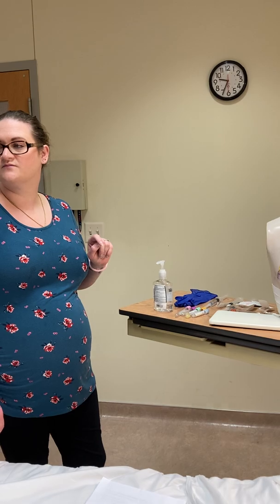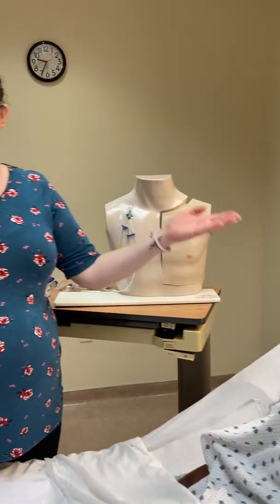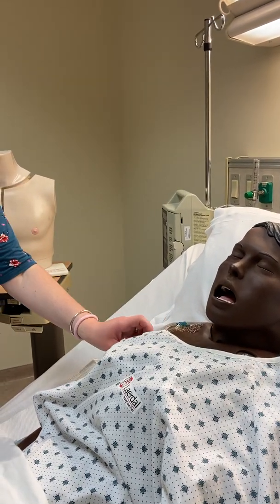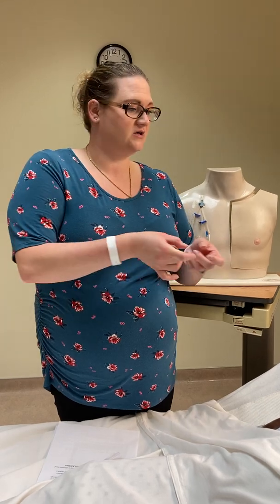For patient positioning, a 30-degree angle is fine. The patient doesn't necessarily need their head turned, but if you're having difficulty getting brisk blood return you may need them to turn their head or raise their arm — these lines can get a little finicky. Never apply excessive pressure when flushing or excessive pulling to get blood return. If gentle attempts aren't working, something else may be going on with the line.